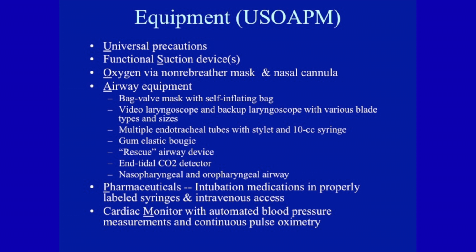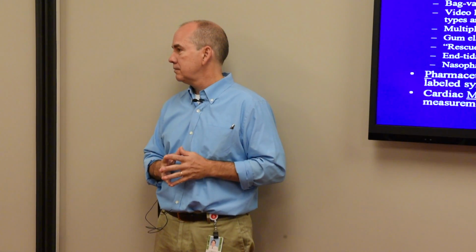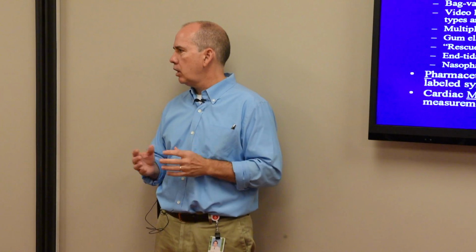All right. And then all your various other equipment. If you can have two IVs, that is great. If anyone's ever been in a rapid sequence intubation when the IV failed, we'll talk a little bit about that and how to handle that as well. All your monitors, stuff like that. And I'm good with questions, so if anyone has questions, don't hesitate to interrupt.